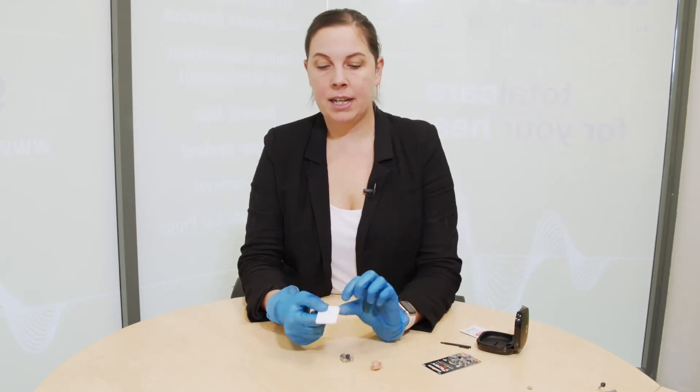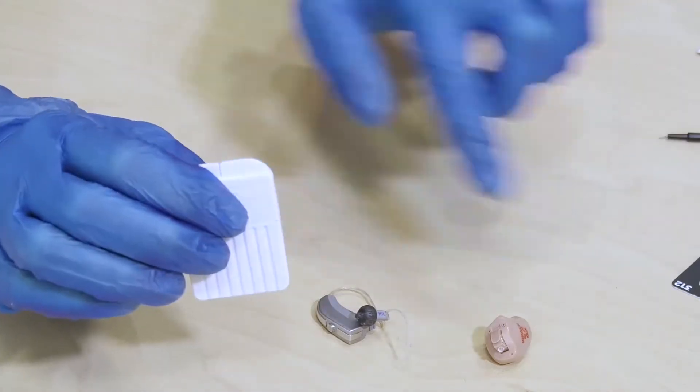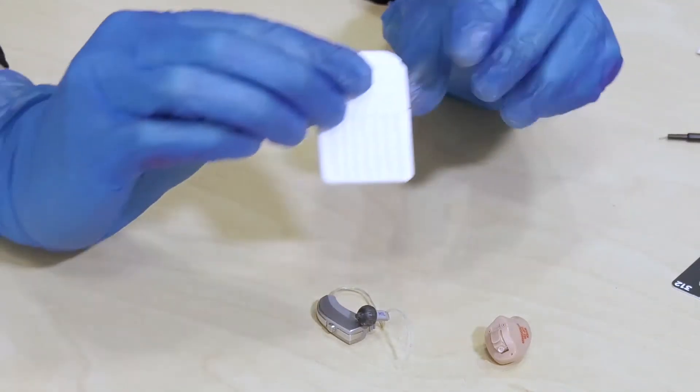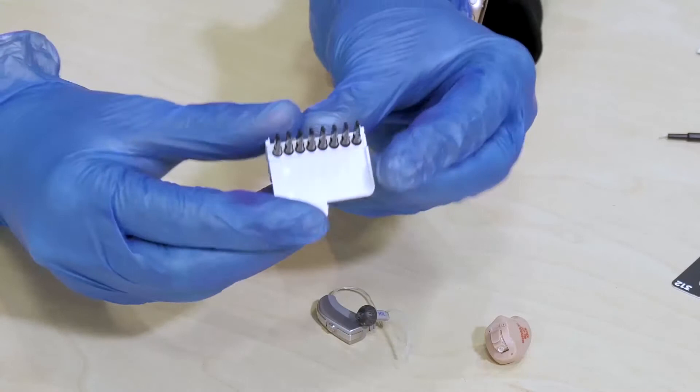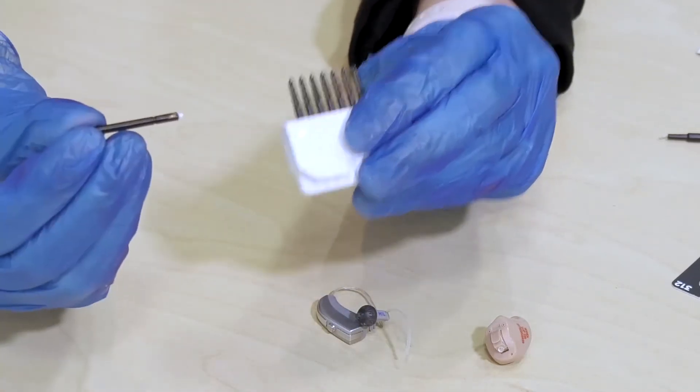Now the wax filter in both of these hearing aids is the same. So what I've got is the ones that come in a packet like this but I'll show you how to change it in both of the hearing aids. So you want to open the packet, take out one of the little black sticks that are inside the packet.